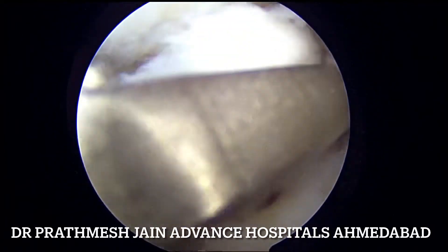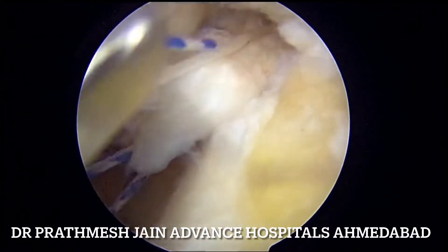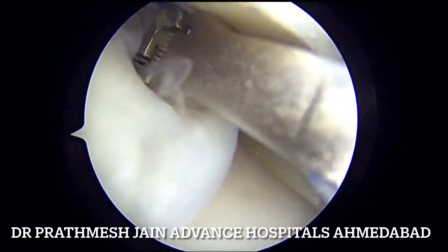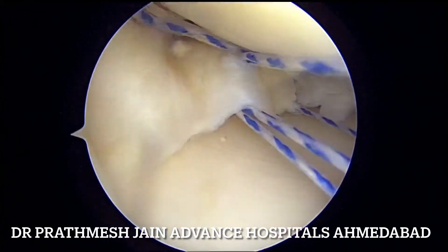We will be passing serial passages — two passages on the posterior part of the meniscus and two passages on the anterior part of the meniscus — and then we will be closing it in a side-to-side fashion so that the radial component of this complex bucket handle and radial component variant is repaired.